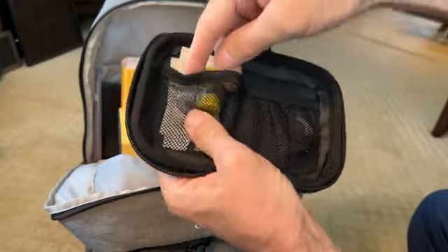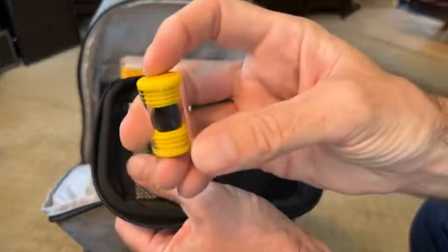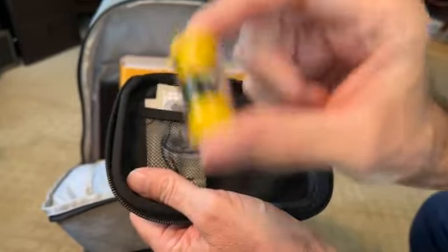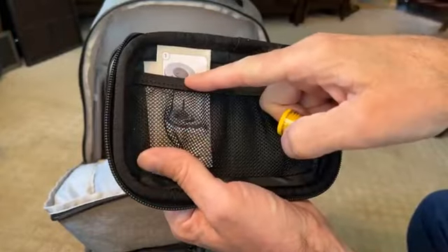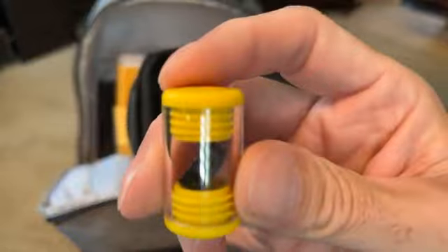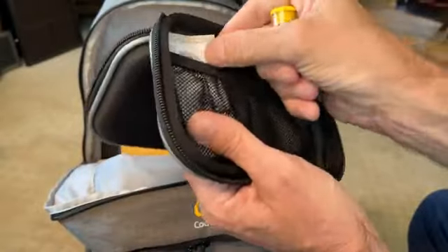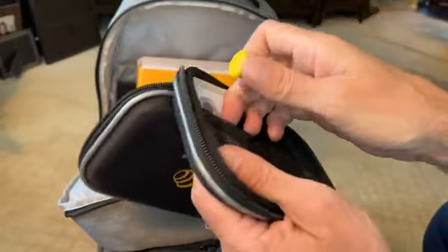You also get a stronger magnet for your implant. Mine seems strong enough, but you get a stronger magnet option. And obviously, instructions on how to switch out your magnet — sorry, I kept saying battery; that's a magnet. You can get a stronger magnet, and there are instructions on how to switch it out.